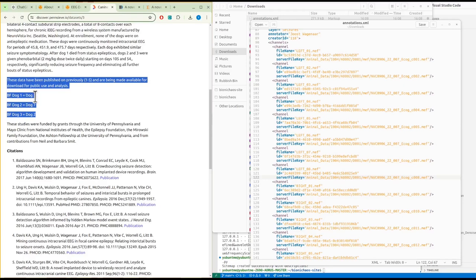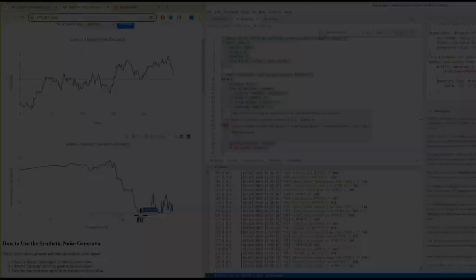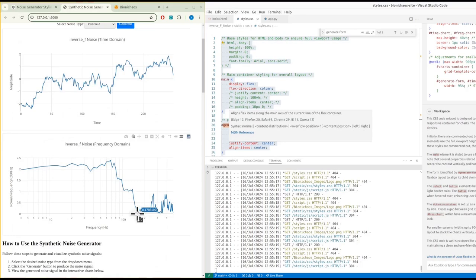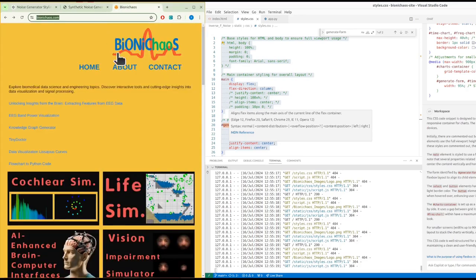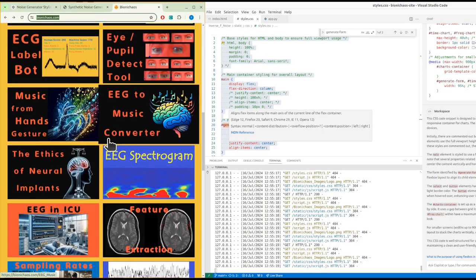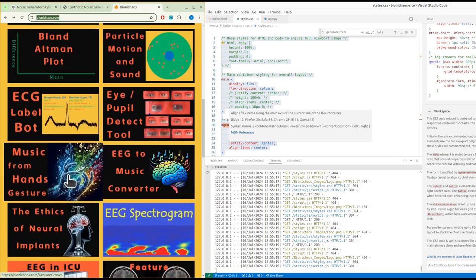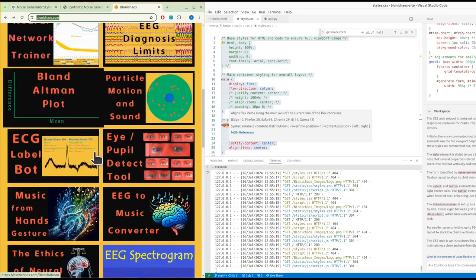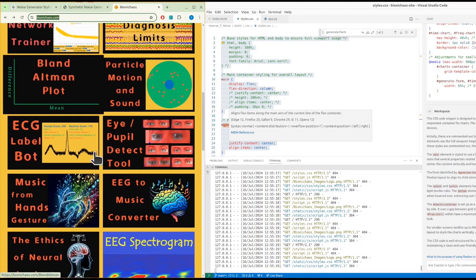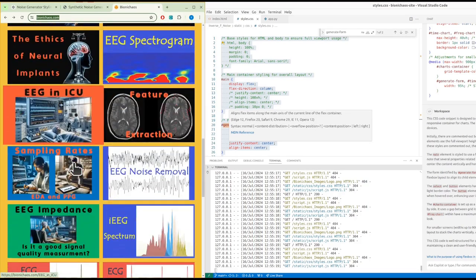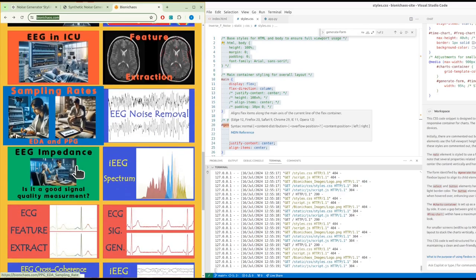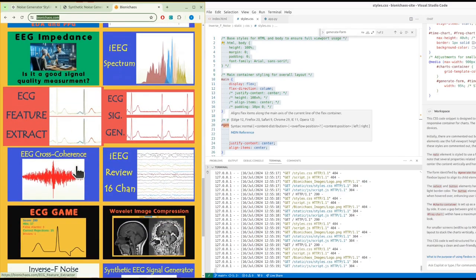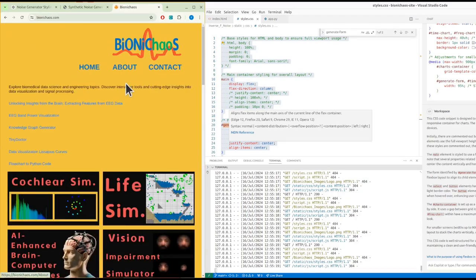Dog one is dog five, dog two is dog seven, dog three is dog two, and we did an update for this application, the inverse f noise, and we stuffed it up so now we're trying to fix it. The main change was that it's now working mainly in JavaScript because it should be faster and using your own electricity instead of my server.